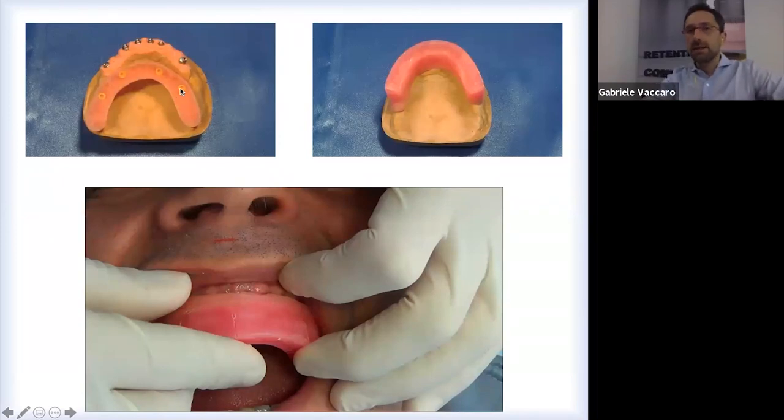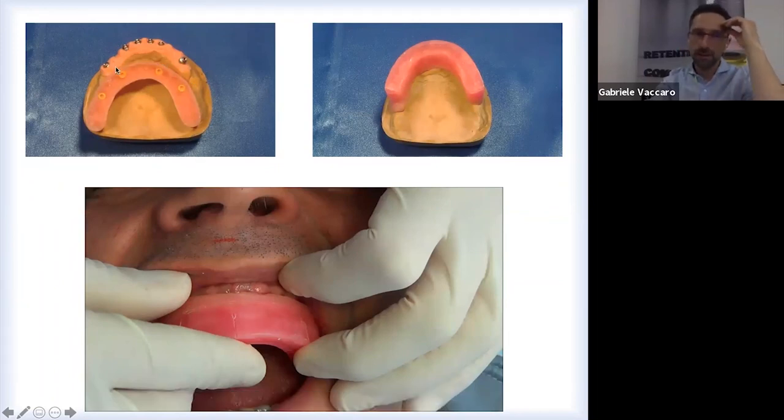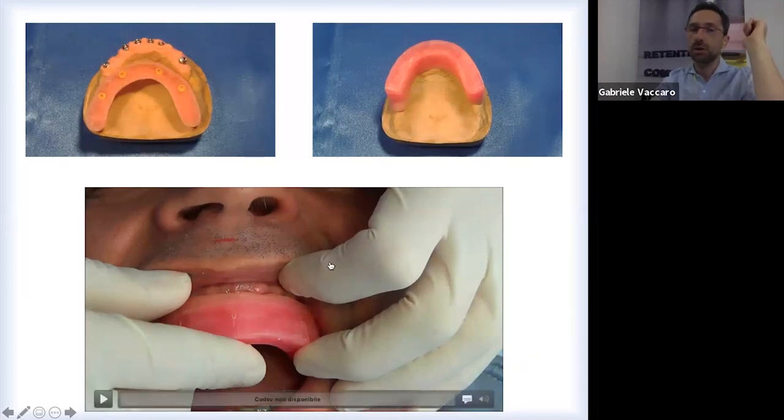Another advantage of this system is that you can check the wax and the height of the vertical dimension when you make the definitive denture, fixed prosthesis bridge, because you can take advantage of the ball. As a matter of fact, it's a ball attachment, of course, and you can use it as a ball attachment during the construction of the prosthesis. You can put inside the resin plate the female cap, exactly the same female cap that we use for the removable prosthesis. So you just have to clip them on the implants with a snap, and we have a very fixed reference point to check the bite, to check the articulation of the patient, and to check the vertical dimension. Without this, I don't know how to do it.